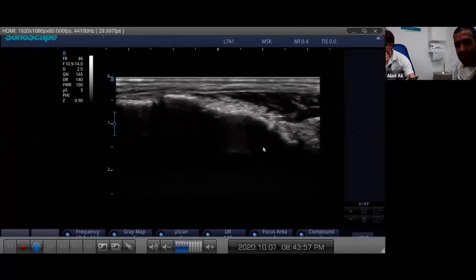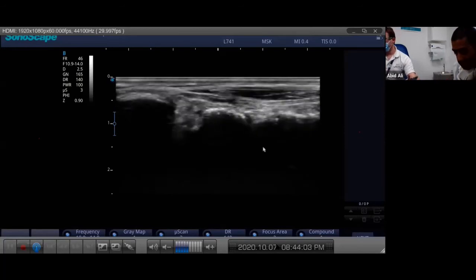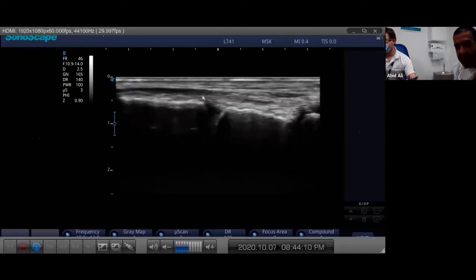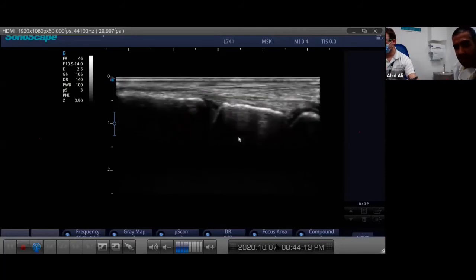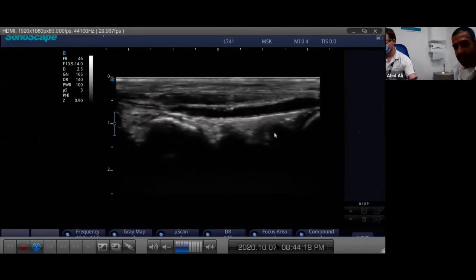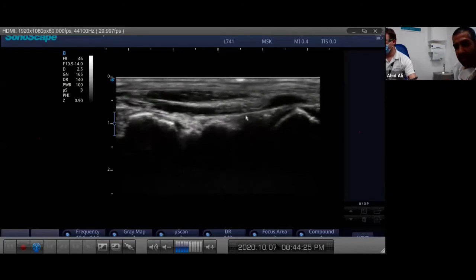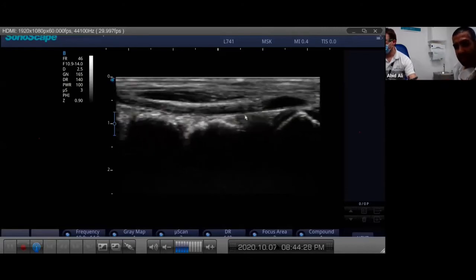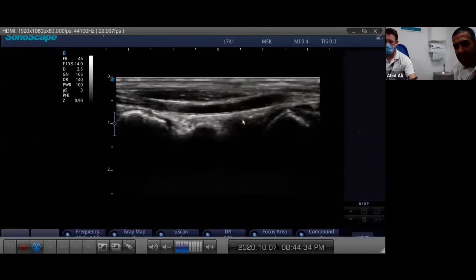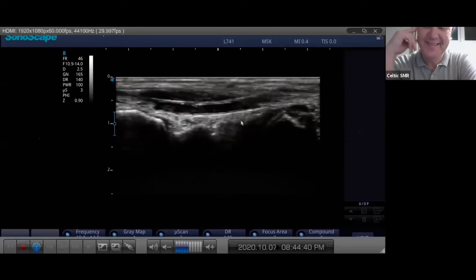Don't forget you can look at things dynamically. Looking at a couple of midfoot joints with a bit of tendon over the top - I'm going to apply some downward pressure and you can gap the joints, rotate them, move them around. You can see your tendons moving dynamically. You can even see the dorsalis pedis moving there as the skin moves. There's some calcific stuff there.